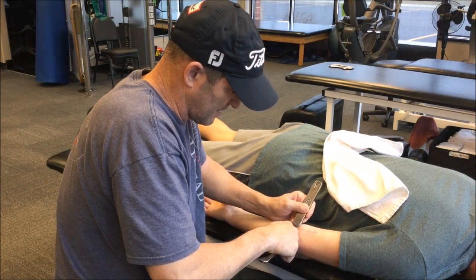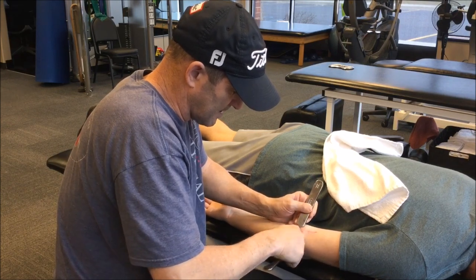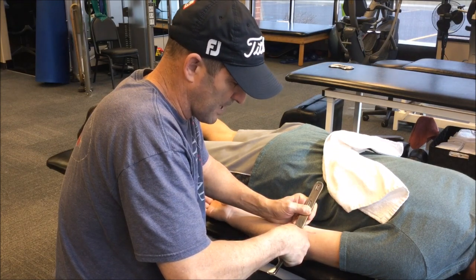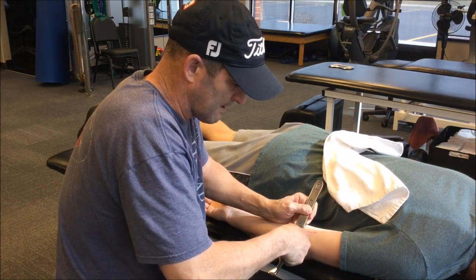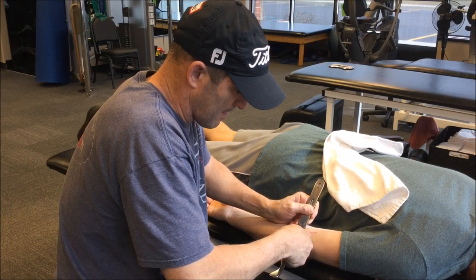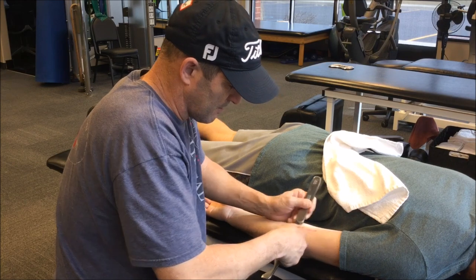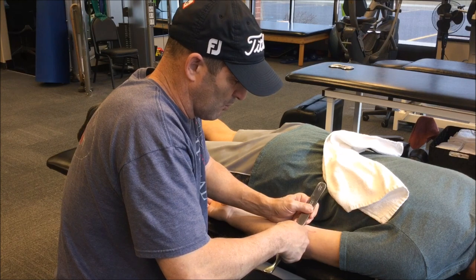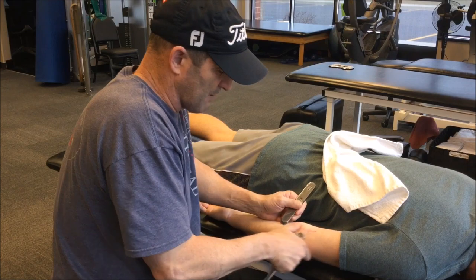Then I'll go right there, side to side. Sometimes you have to be very careful because if you push too hard — I'll just apply a constant pressure to it. You can apply it in multiple directions and multiple planes, but you lift the scar and mobilize as you pull towards the sky. It's very, very effective for scar mobility.